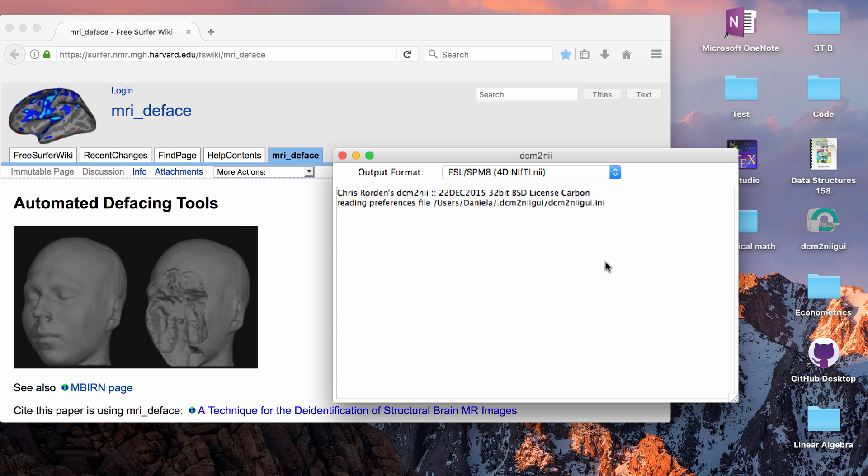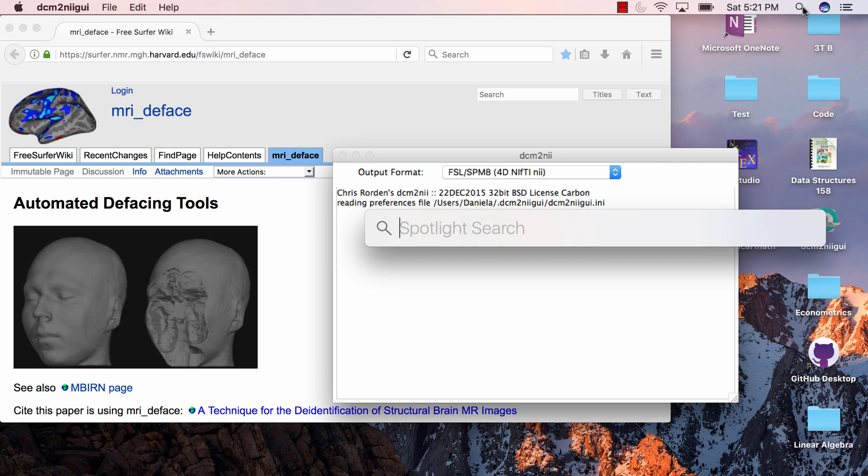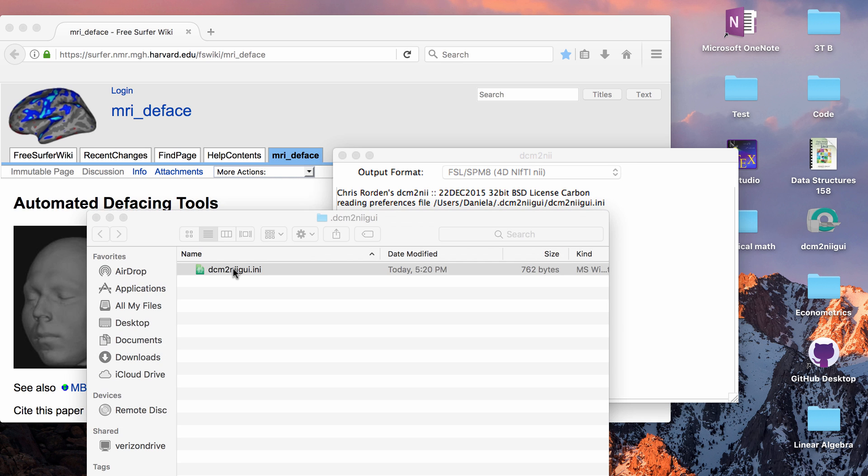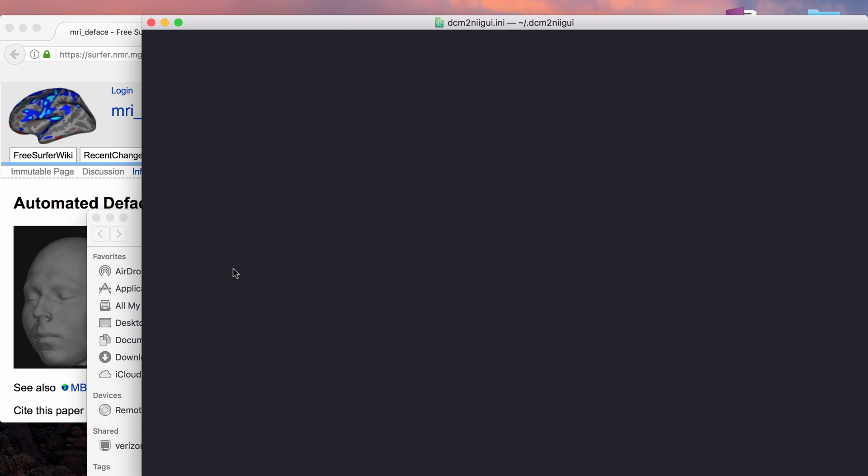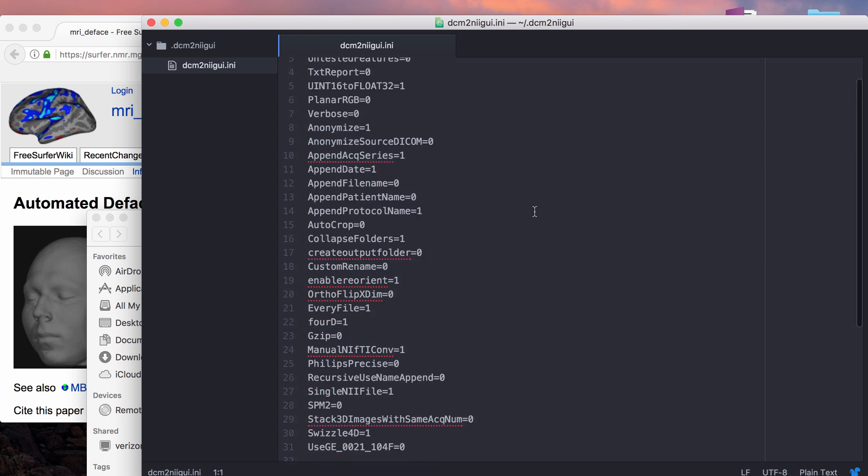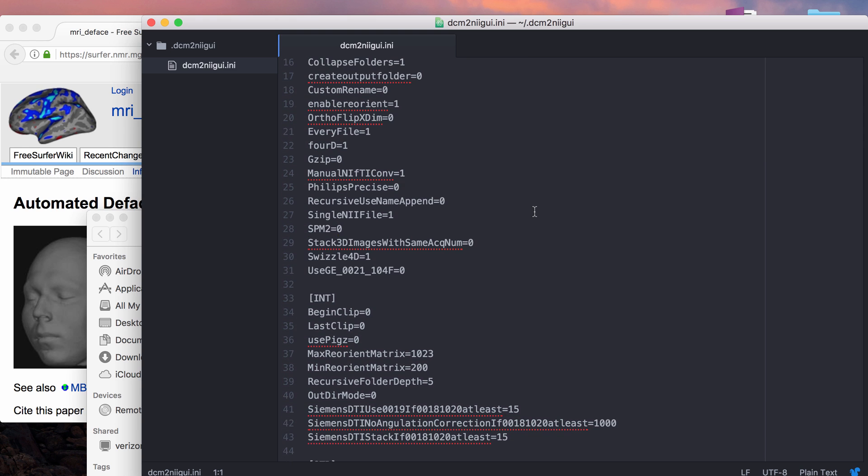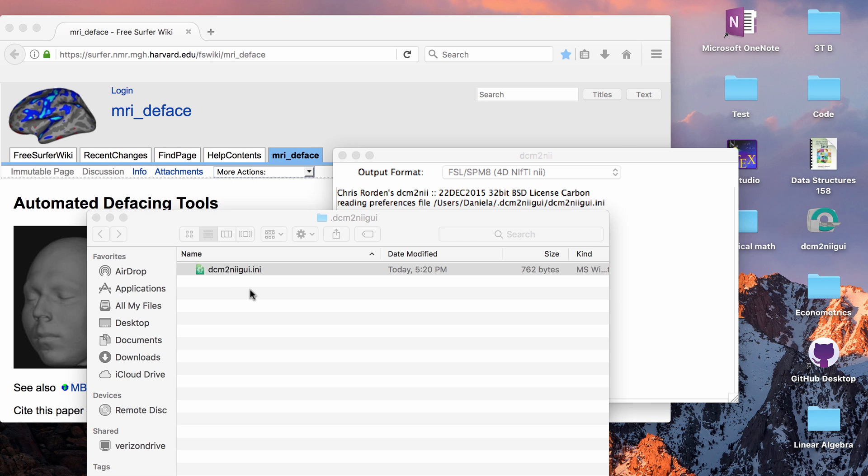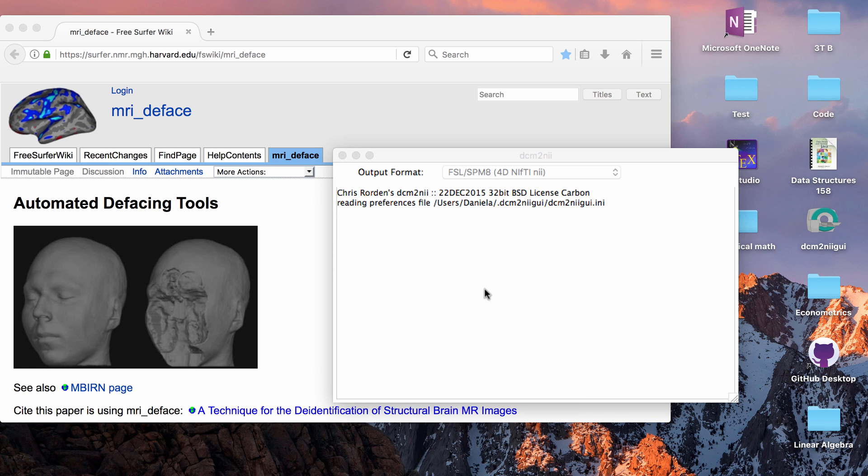So when you open DICOM to NIFTI GUI, it will tell you that it's reading from a preferences file and then it will give you the file path. If you open the file that it's talking about, you'll see that it has lots of different options that you can customize as either true or false and the default that it comes with is to anonymize the NIFTIs. So really anytime you convert from DICOMs to NIFTIs, if you have the default settings, it will automatically de-identify the data.